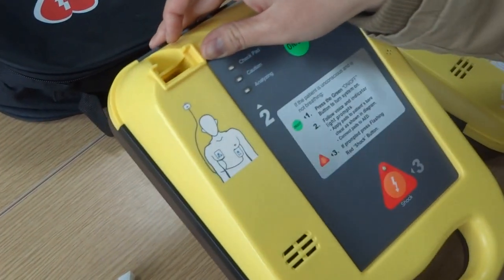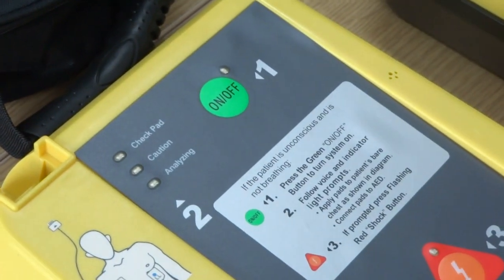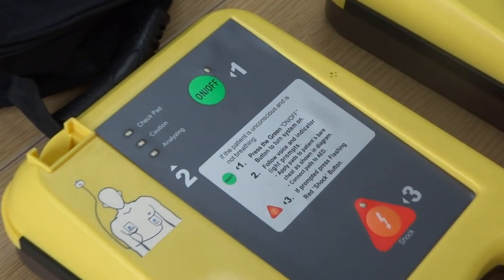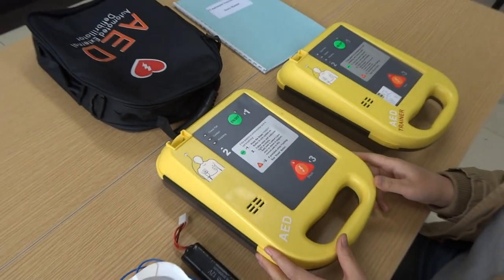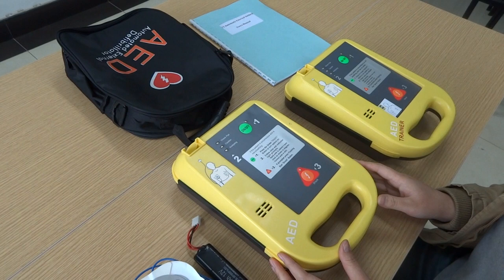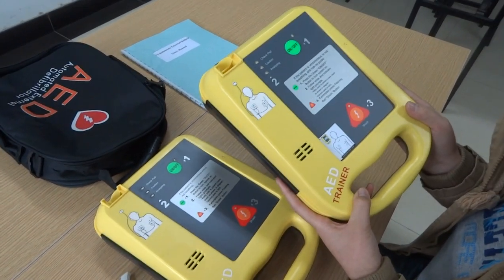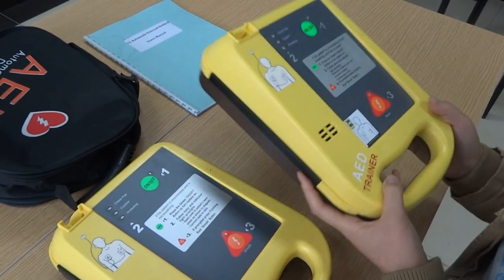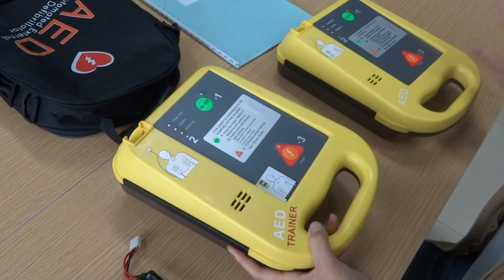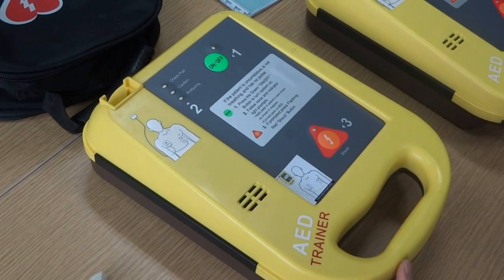This is the connector for the electrical pads. This is our real device, but because we cannot operate it in a demonstration — it must be used in a real situation — we will show the operation through this AED trainer. The AED trainer has the same operating process as the real device.